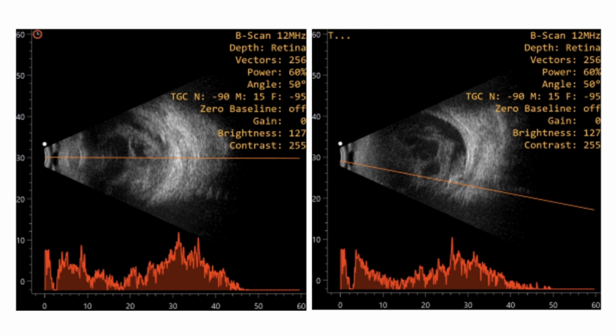So in this scan also, which is showing this one single spike, ideally the gain should be reduced to make it more prominent, because this spike that you see and the thin line that you see is not very much confirmatory of a foreign body. So for any foreign body, you must always have two scans, one with a lower gain, which shows that the foreign body spike is still persistent.